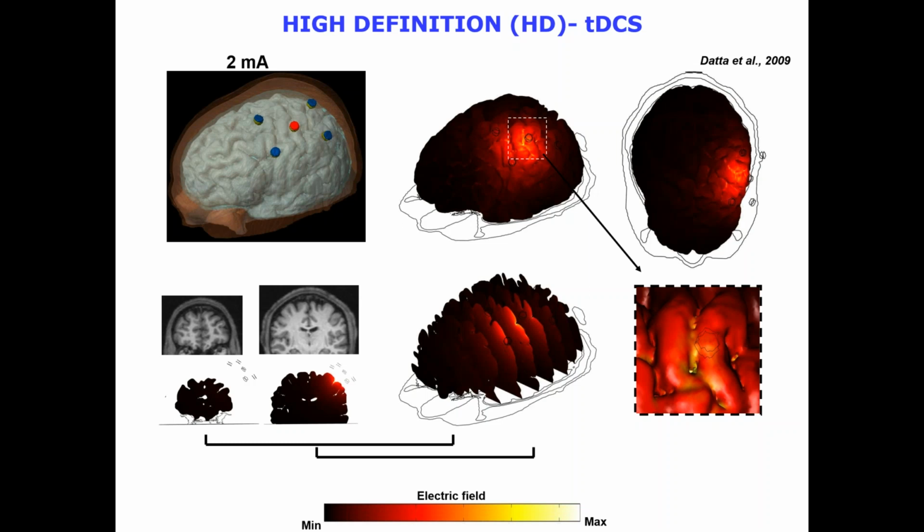And the reason is because we want to compare this tDCS with another form or 2 forms of non-invasive neuromodulation. So we might then bring them back 6 weeks later and try, in this case, tACS, which is an alternating current, and we can pick the current.